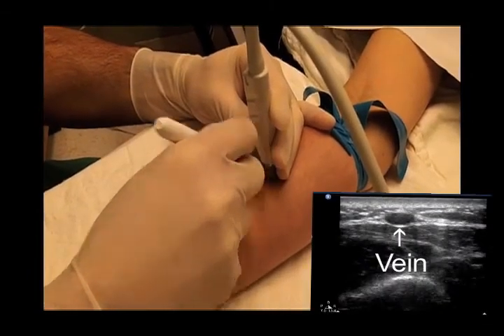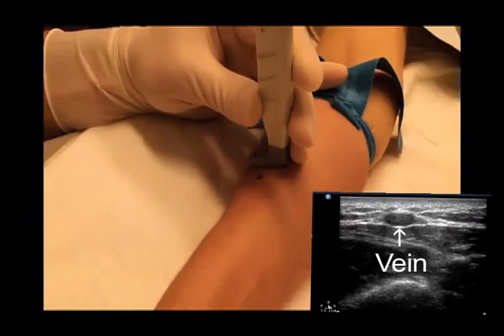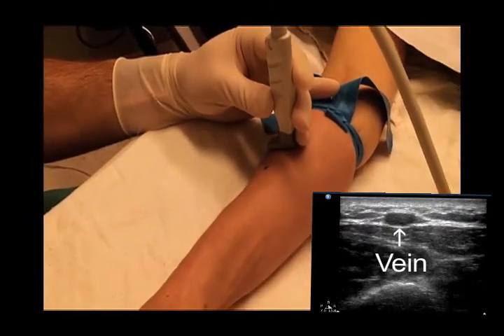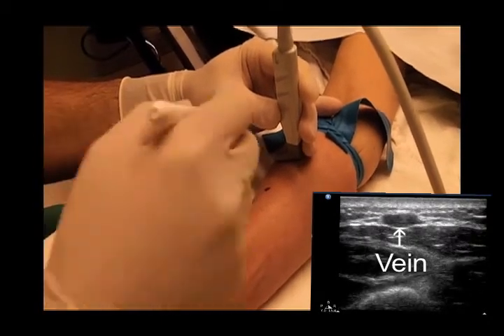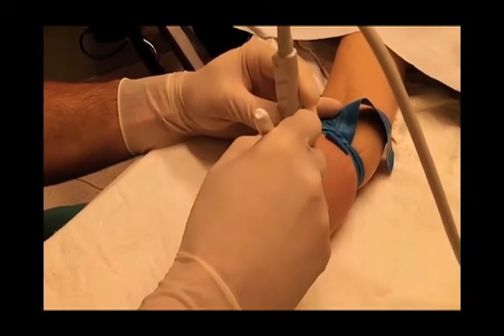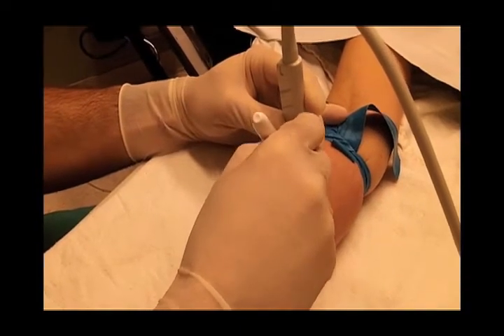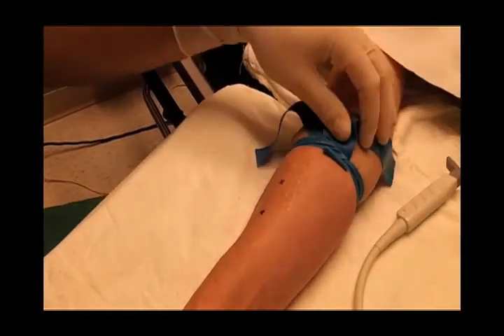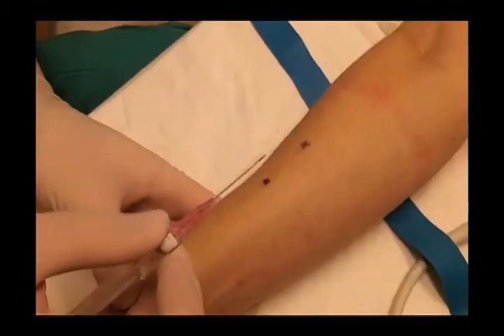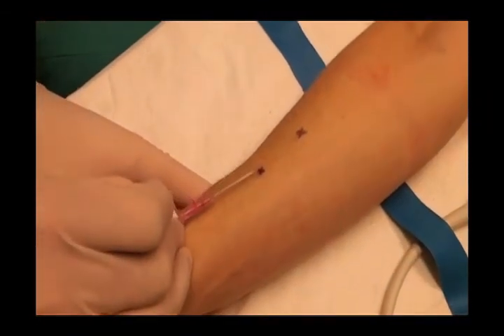The first skin mark is made here, the ultrasound transducer is moved proximal, and a second skin mark is made. Since you know the trajectory, you would simply now insert the needle as you normally would.